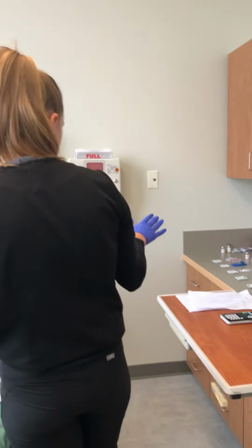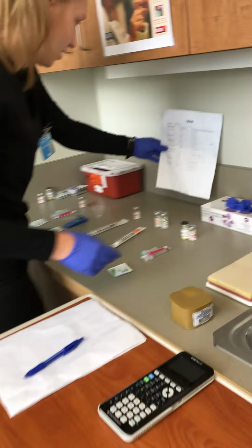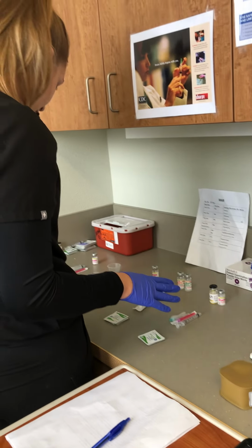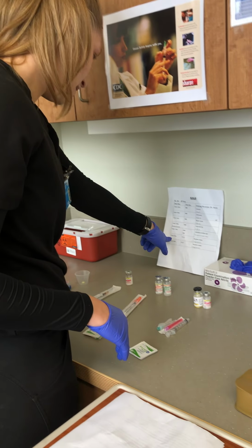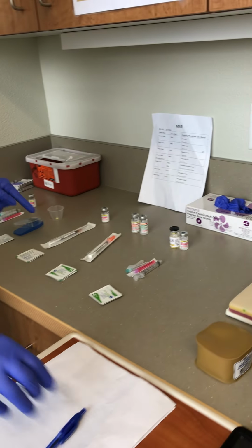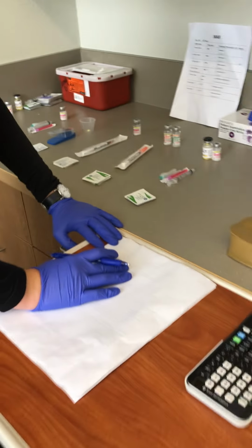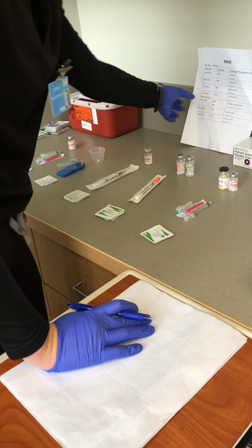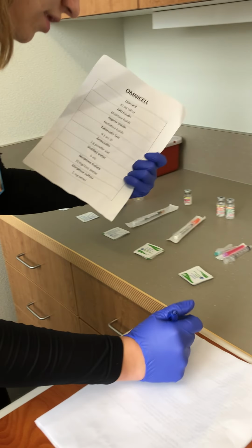Okay, now I'm going to go ahead and start drawing up my medications. So I have my MAR down here. First I'm going to get ready my morphine sulfate, because that's what I'm going to administer first. For this one I have to do some dosage calculations. So I've changed this order to 10 milligrams, and I have available 20 milligram to 1 milliliter bottle.